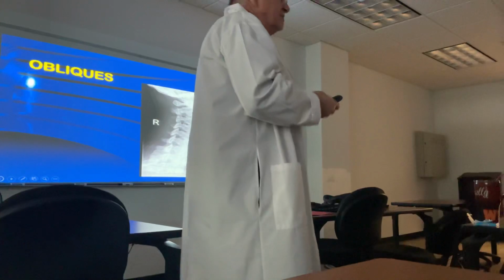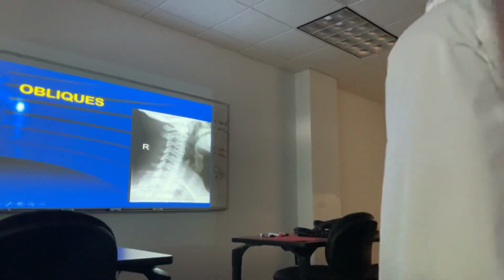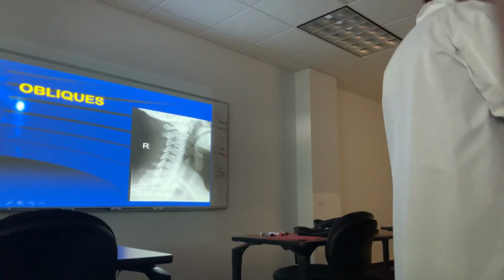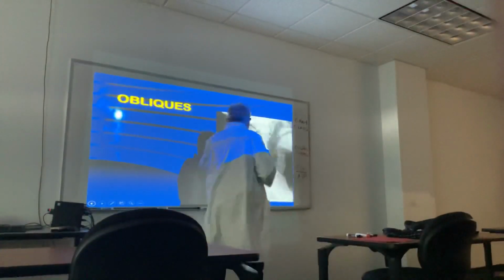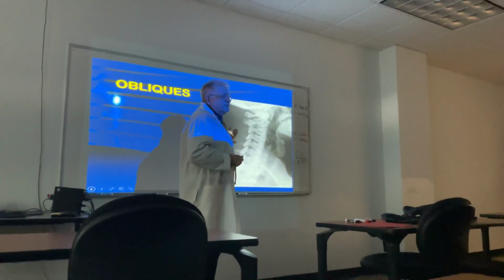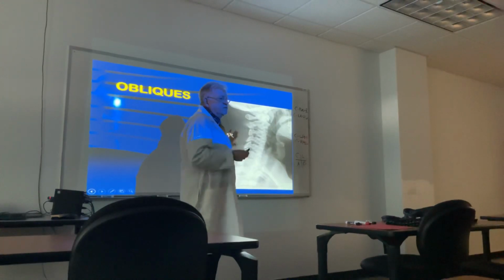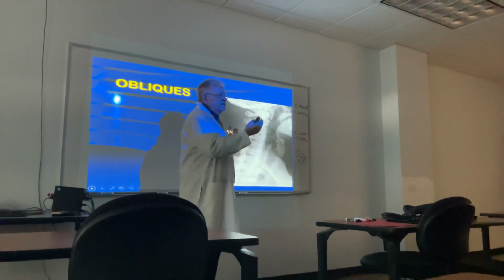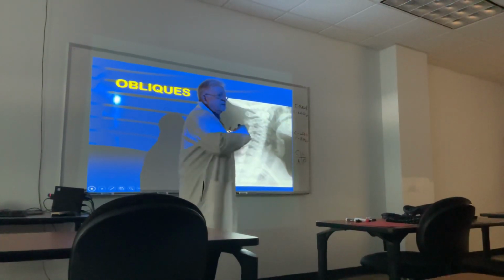They call in the specialist, not me, somebody else like me, and they say, I'm sorry. The way most chiropractic colleges do this is, if the anterior portion is against the chest, this should have been the left marker. It doesn't even get to court, the attorney would say, I can't use that document, it's obviously false. If it slips through your cracks and his cracks, the opposing attorney is going to have a field day, because this is wrong.